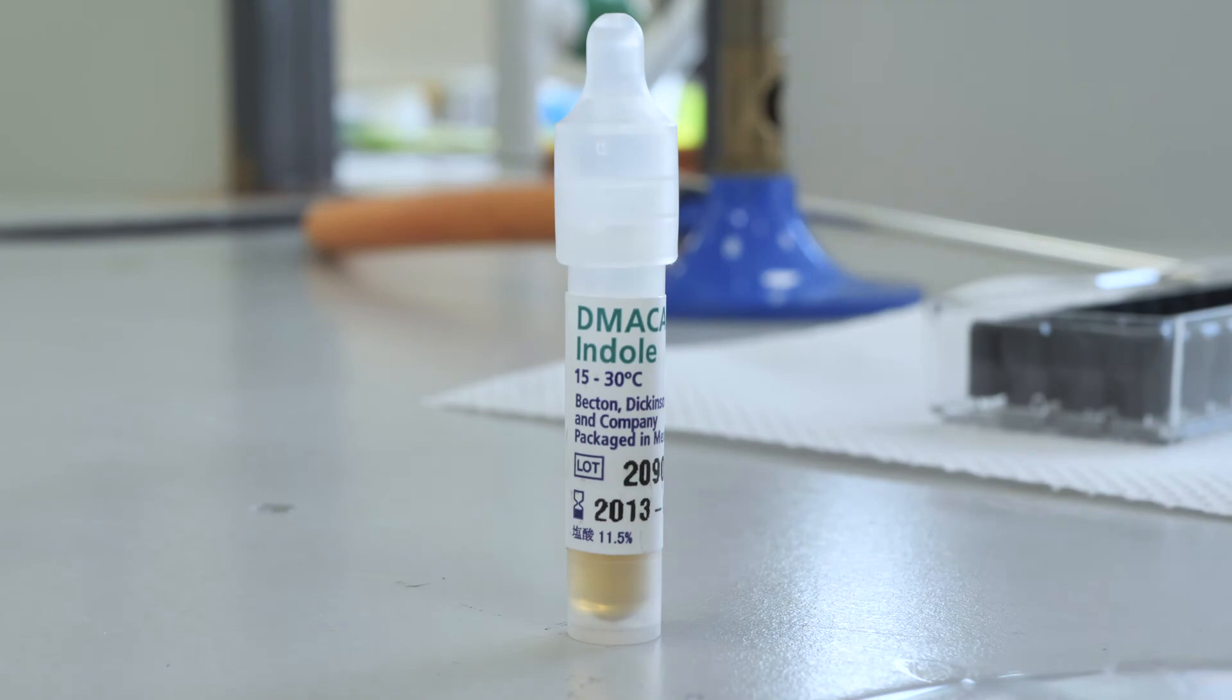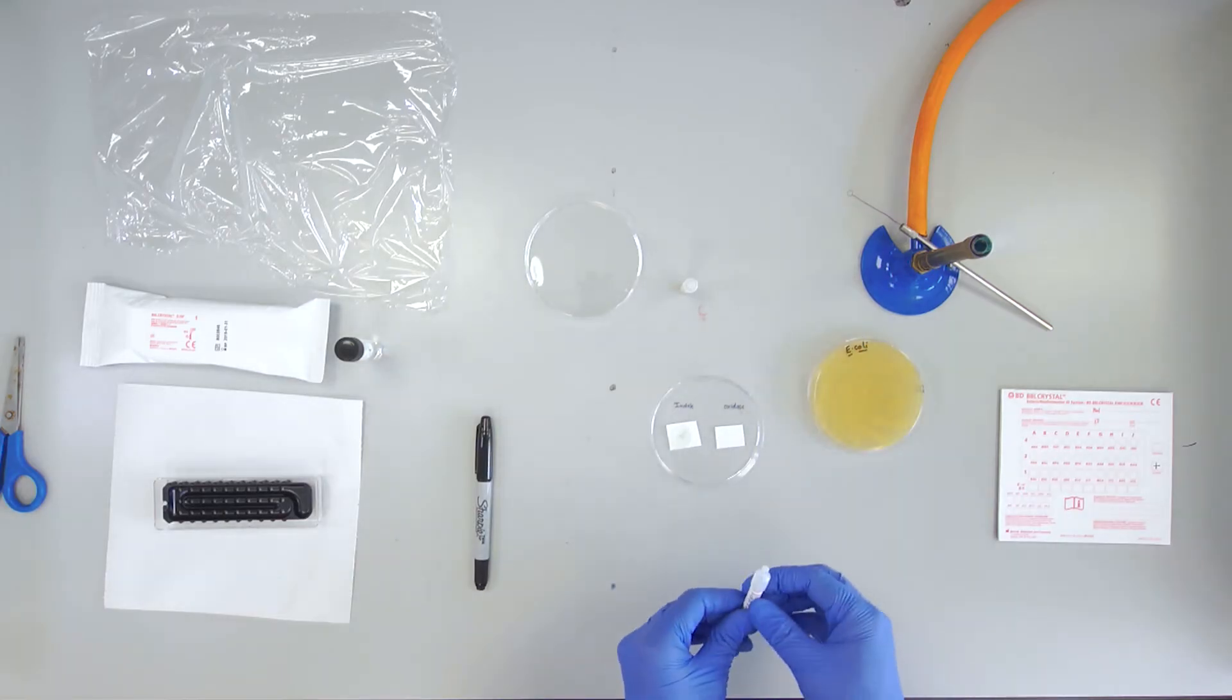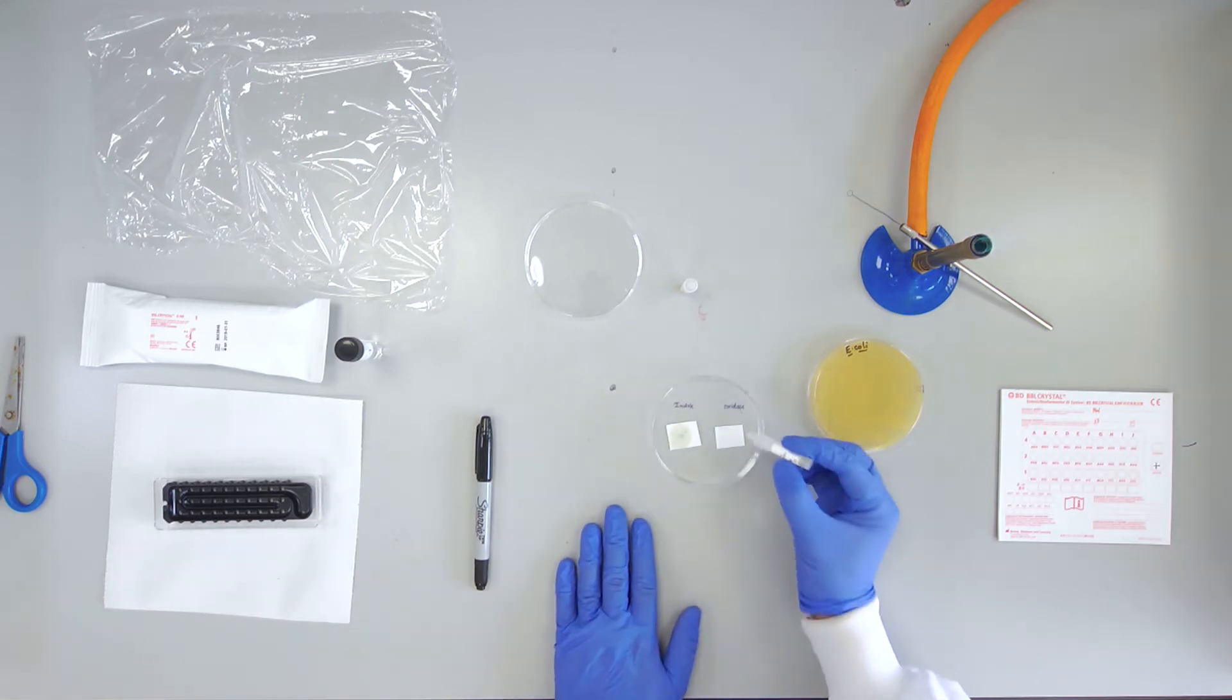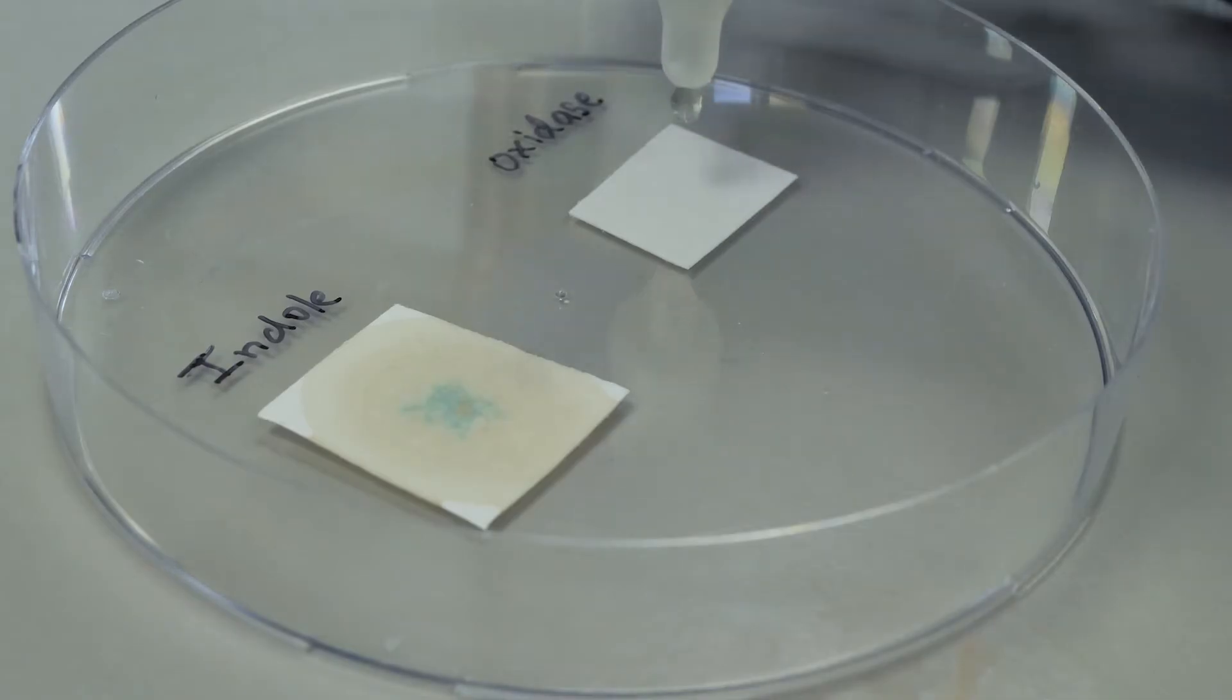On the second piece of filter paper add a few drops of the oxidase test vial and aseptically transfer another colony to the paper and mix.